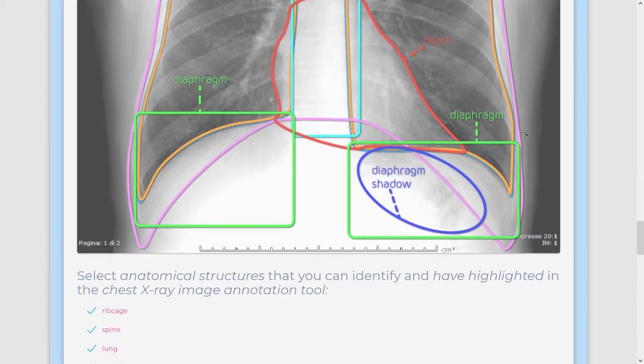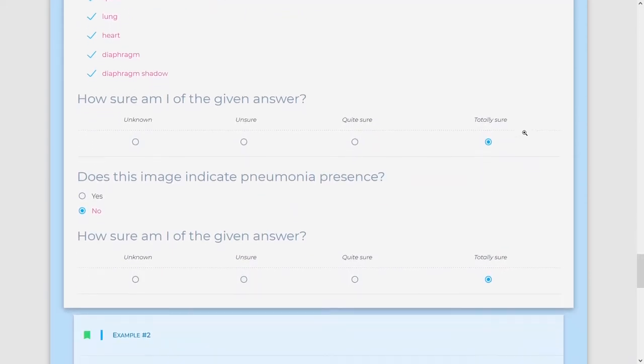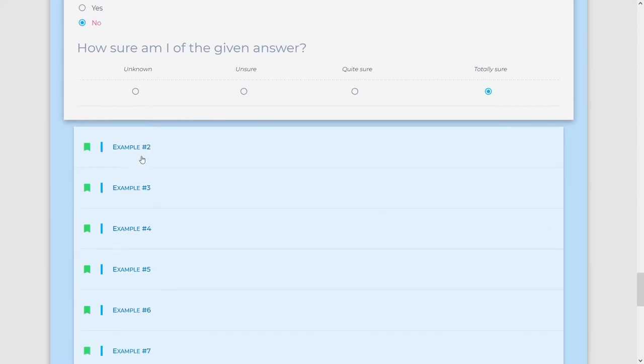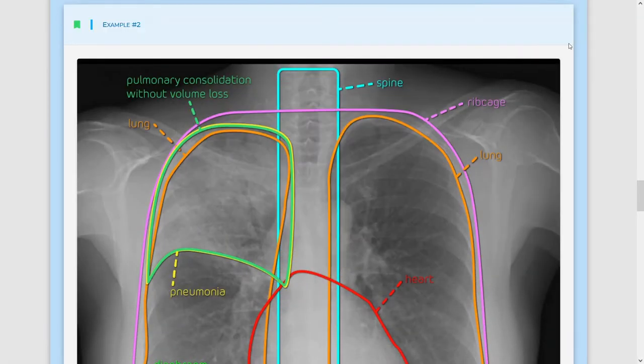The annotations of each image will be accompanied by the answers to two or four questions, contained in a form associated with the same X-ray image, specifying the degree of confidence for each of the provided answers. To complete the instructions in the annotator guide, some examples of a correct and complete annotation follow.